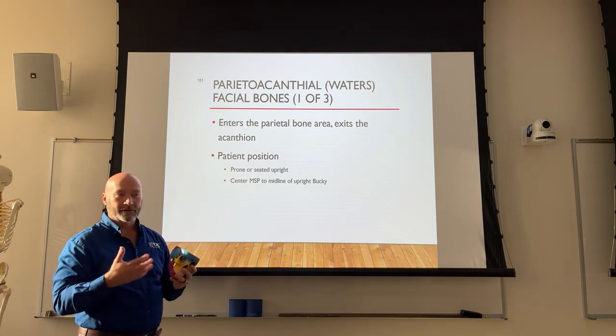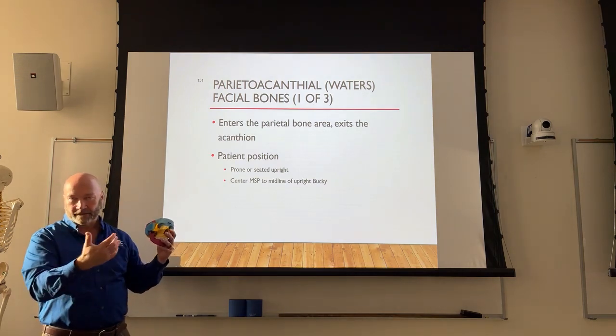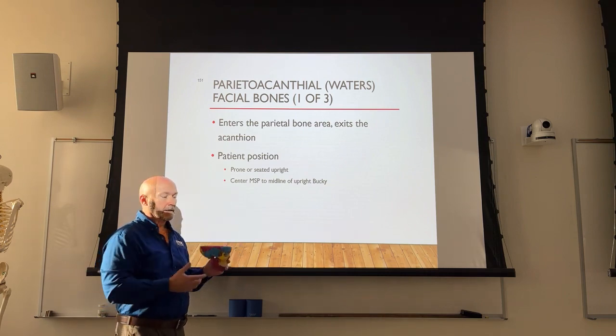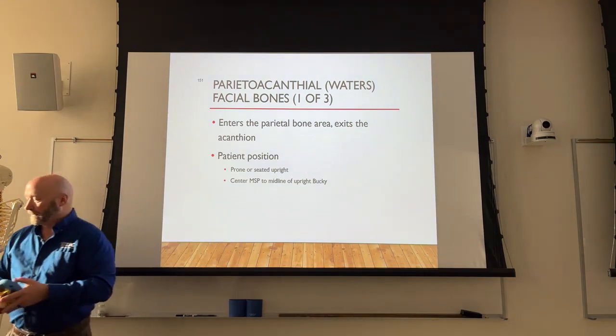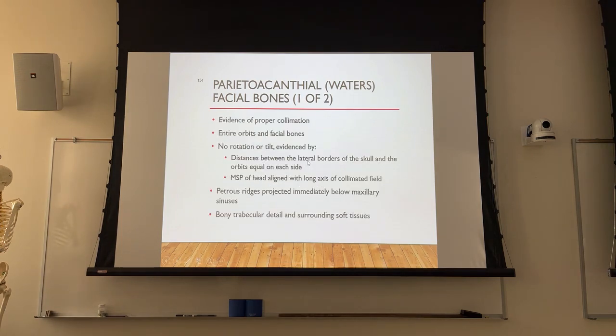Sinuses. In the sinuses, right. We're going to see it again in the sinuses. Even though this is not one that we've recycled, we will recycle it over and over again. As a matter of fact, I think this is one of the few views of the skull we actually might need to hang on to, and I'll show you why.